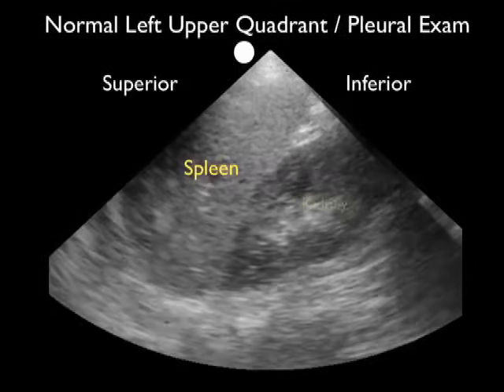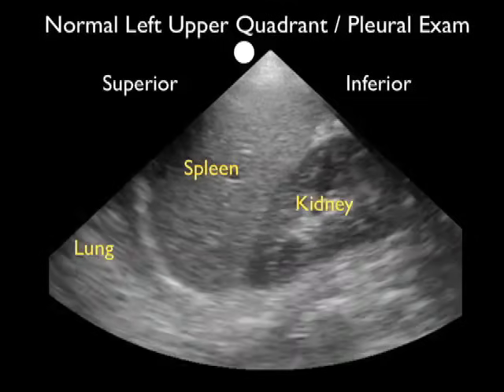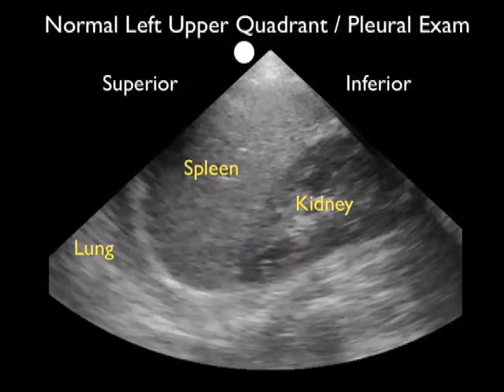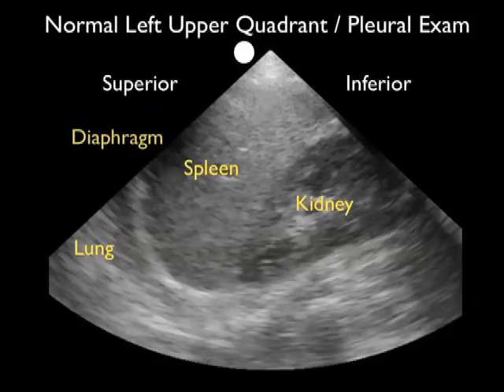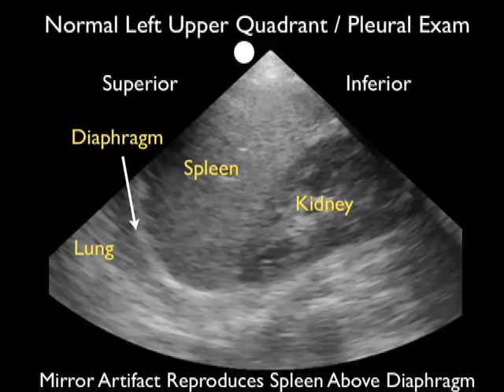Now let's take a look at a normal left upper quadrant pleural exam. Again, we're in a long axis configuration, so superior to the left and inferior to the right. We see the spleen in the middle of the image, and we see the diaphragm moving up and down as the patient breathes. Looking above the diaphragm into the thoracic cavity, we again see that mirror artifact — it looks almost like a reproduction of the spleen within the thoracic cavity. This is a normal finding and is not to be confused with fluid. Fluid will appear very differently, with the appearance of a dark or anechoic stripe right above the diaphragm.